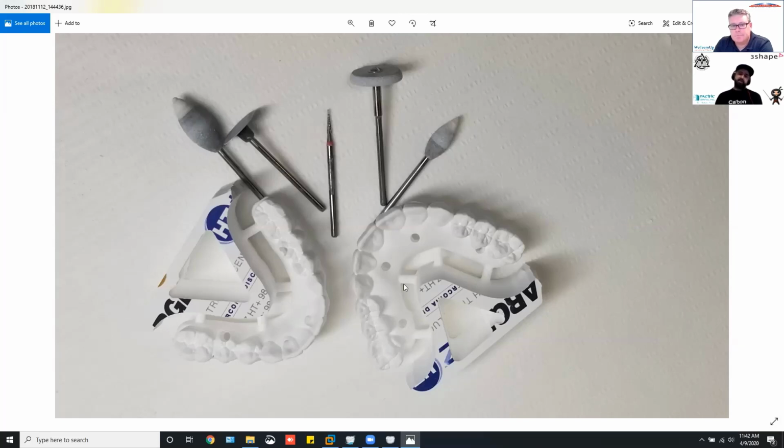And like I said, they actually have a green state. But I think these, it's a 50-50 green state finish and 50-50 finish on the sintered state. If not, it may be 60-40, 70-30. Okay. Yeah, it all depends. Each case is unique. Yeah, and you know, some like the Sum 3D and the Roland 51s, not the 50s or the 52s, but the 51s, you had 90-degree vertical milling. So that 0.3 can get in there and clean out those anterior embrasures, and you almost have zero finish time.